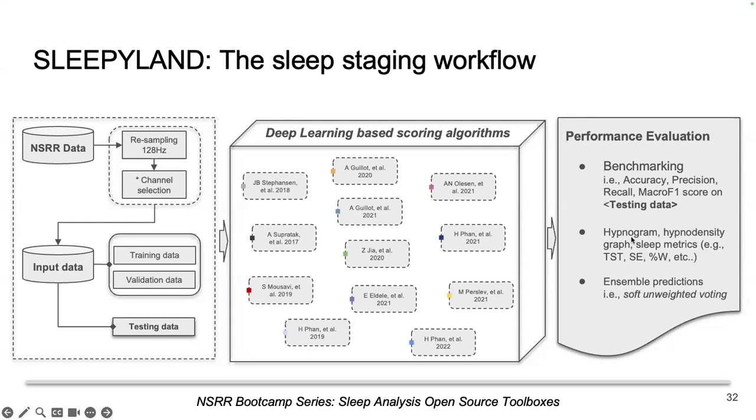Among the visualization and evaluation tools, we are also exposing some plots like hypnogram and hypnodensity graph. I'm going to explain that in the UI once I show you the UI. And we are also computing all the sleep metrics, for example, total sleep time, sleep efficiency, and so on.